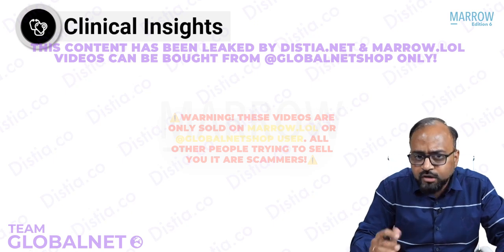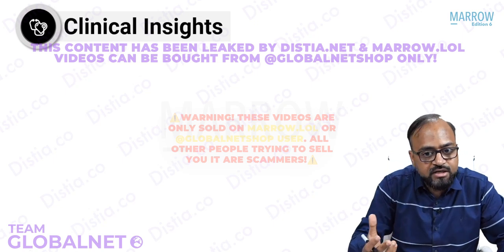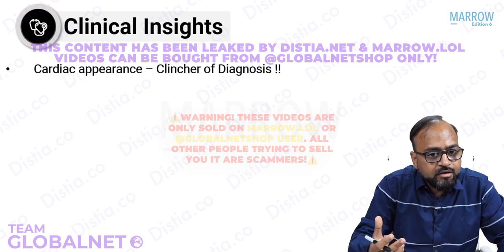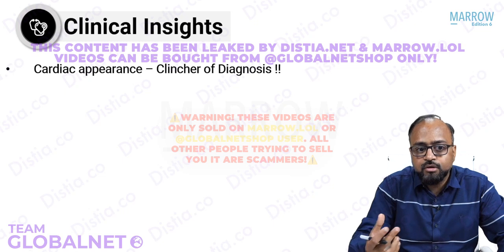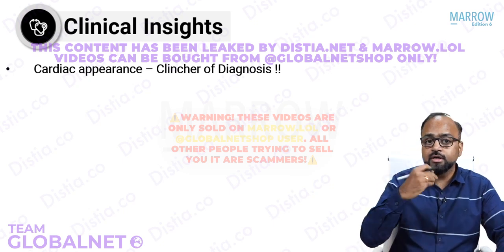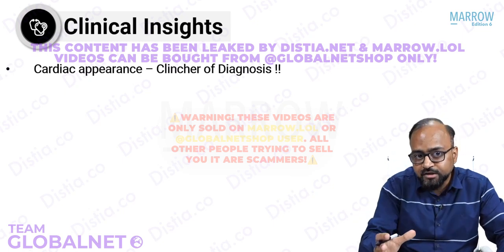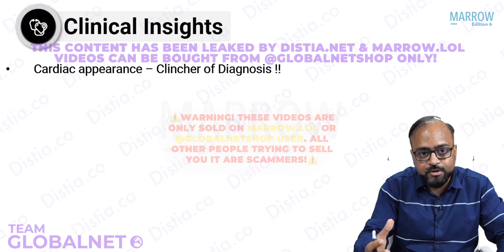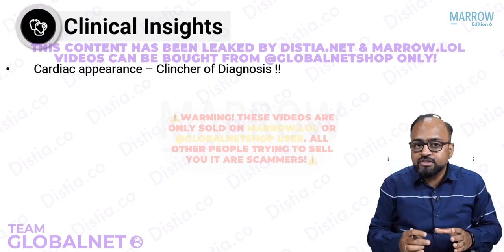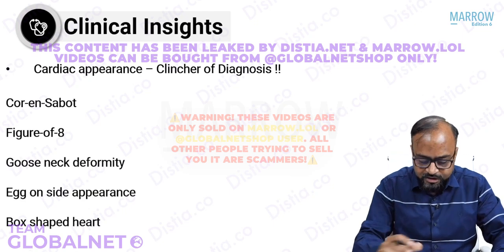Right. Now, what is basically important for you for your exam levels as far as congenital heart diseases are concerned? Various cardiac appearances are a clincher of a diagnosis. Along with these appearances, when you study the clinical presentation in pediatrics, that will lead to a more complete discussion, and that is something which will be completed in your pediatric videos. What we have achieved here basically is we have looked at the various classical imaging appearances. Right, let us quickly revise them.